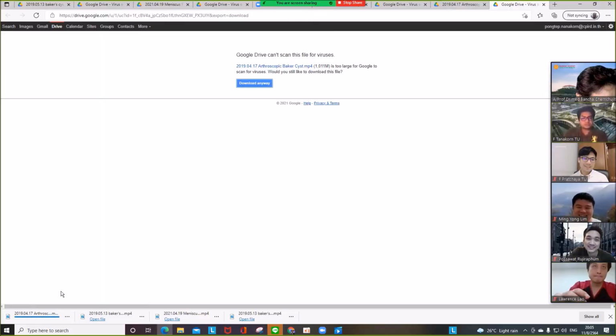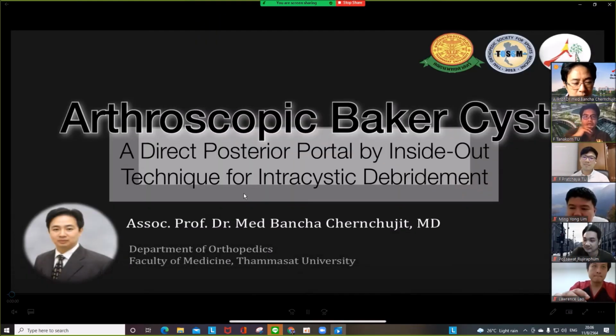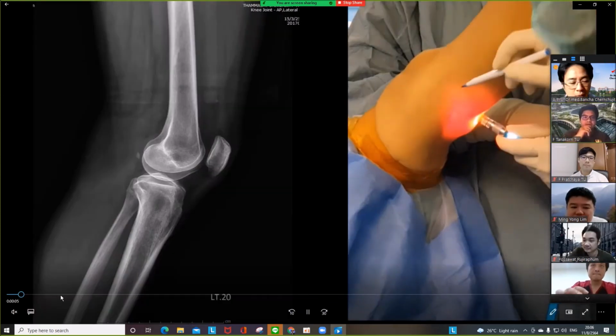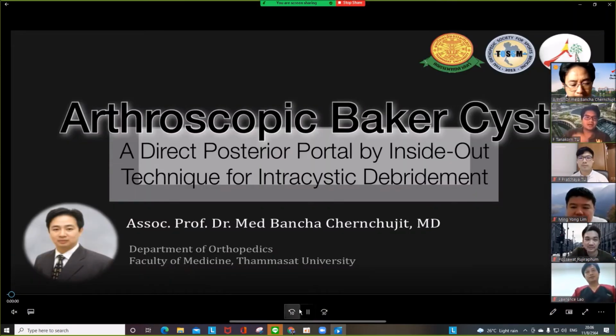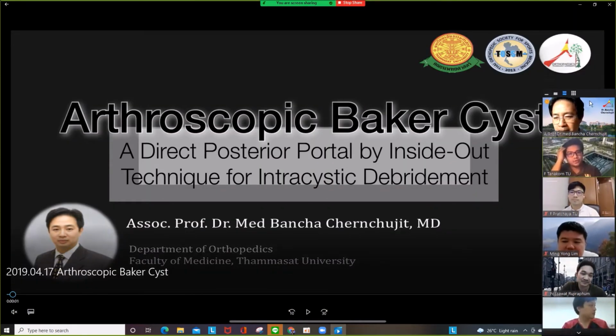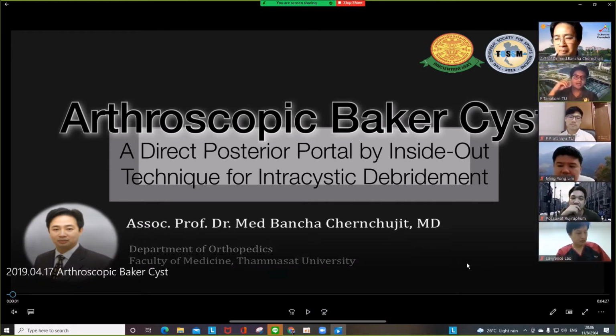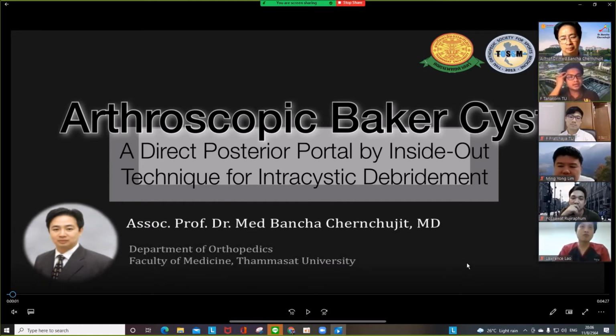Professor, I have a question. Is it possible that I cannot find the valve without the dye injection before arthroscopy? What do you mean? I'm afraid if I have no dye injected into the cyst and I go for arthroscopic surgery, I cannot find the valve.